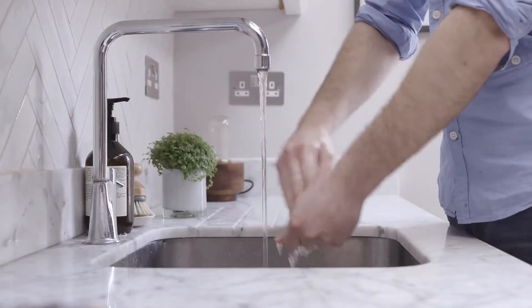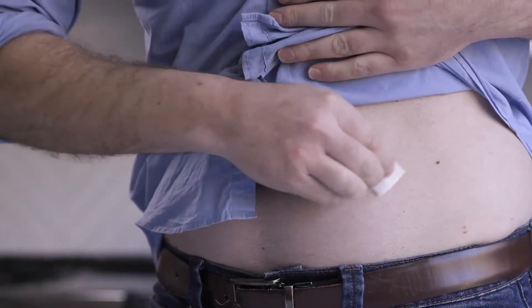Before you begin, wash your hands. Then clean your skin with rubbing alcohol and let it dry.